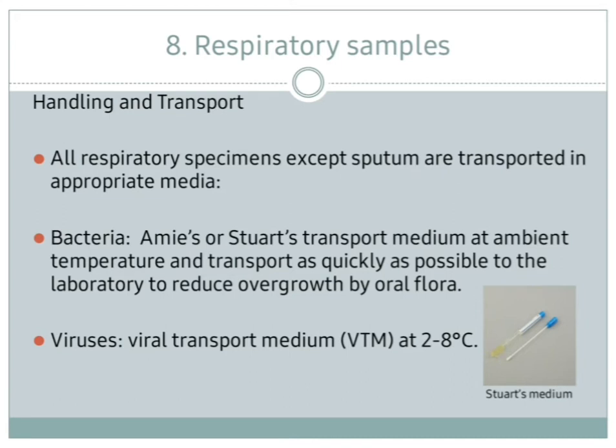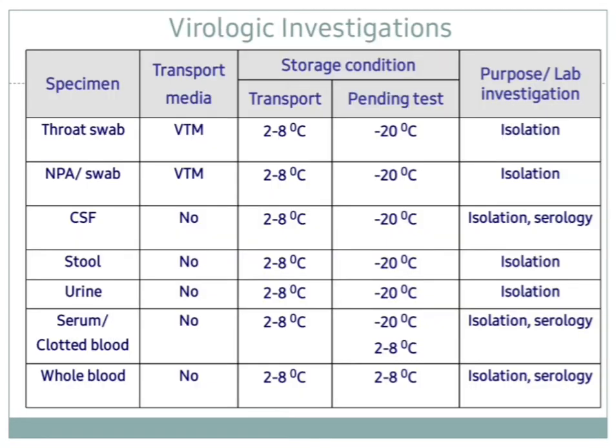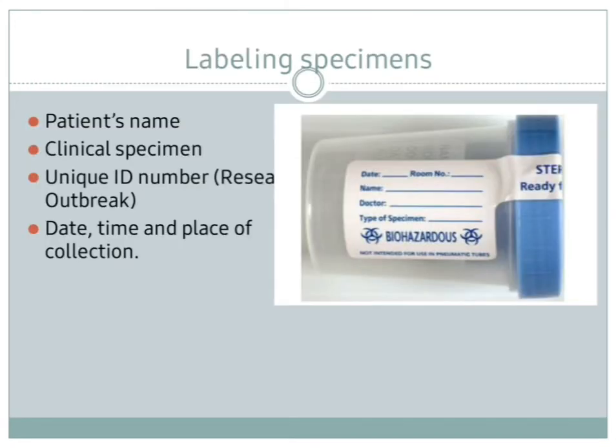Viruses by viral transport medium at 2 to 8 degrees centigrade. Now this table shows us some specimens regarding the virological investigations. The transport medium that we use if we need storage, transport, pending test, and the laboratory investigation that is done for it regarding the virological investigation.